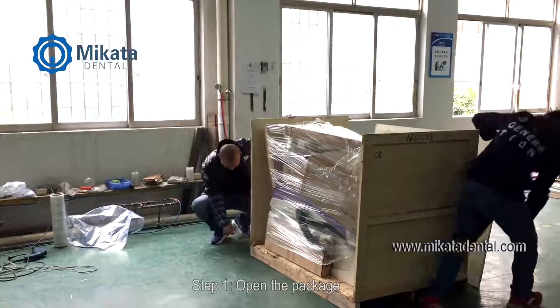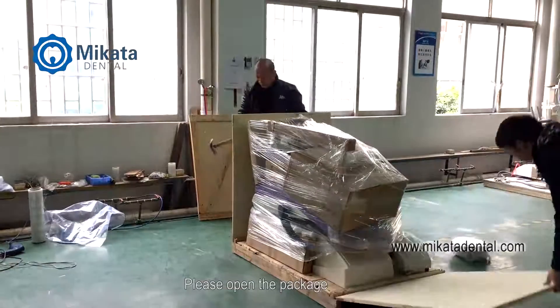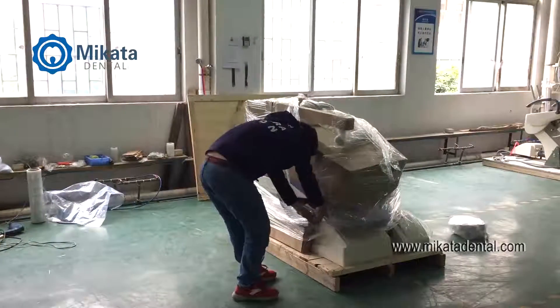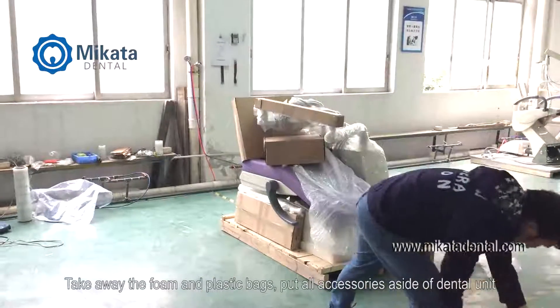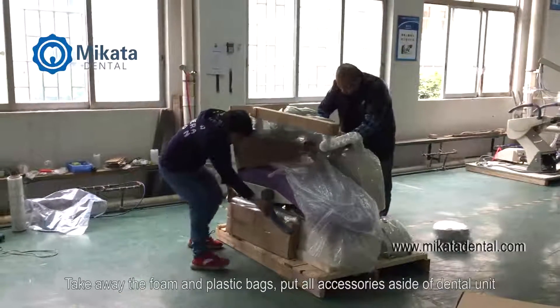Step 1. Open the package. Take away the foam and plastic bags. Put all accessories aside from the dental unit.